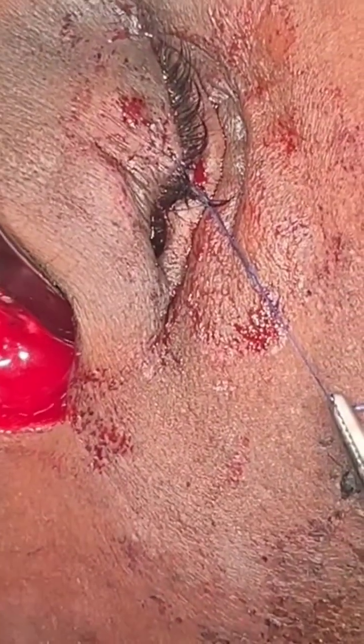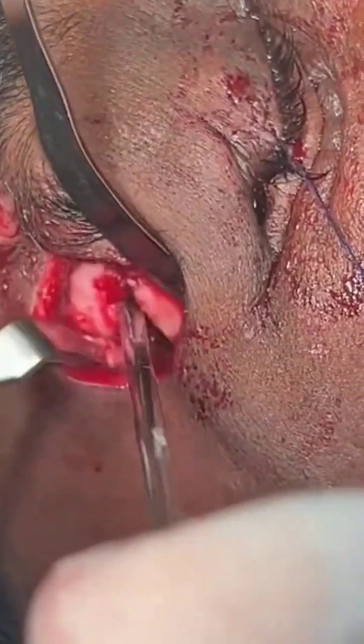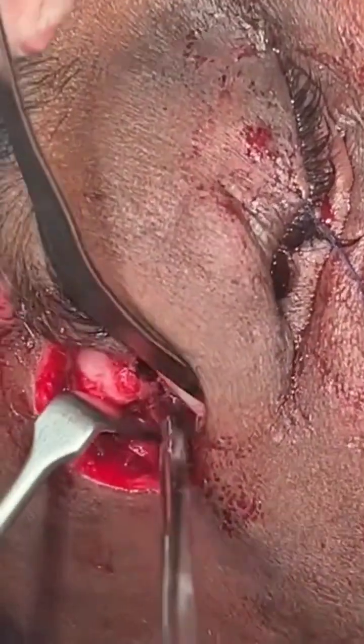That was the approach. This scar is not going to be visible. And then we've exposed the frontal zygomatic region. So out here there's another fracture — you can see that little gap there. And then eventually we've also exposed it intraorally.